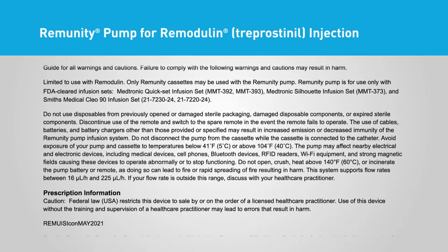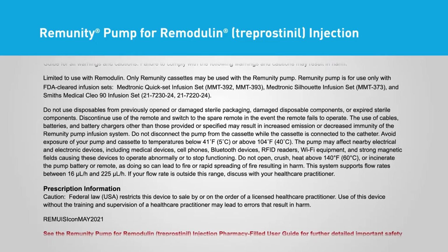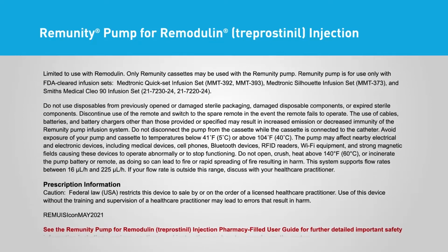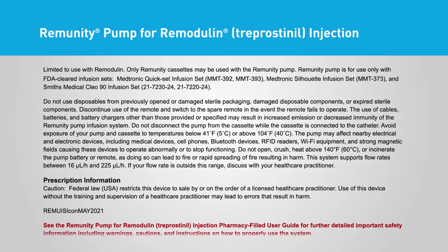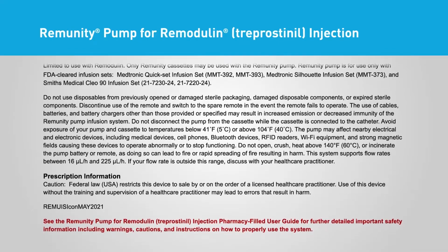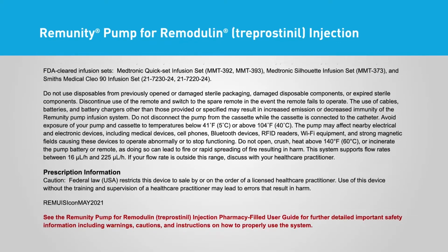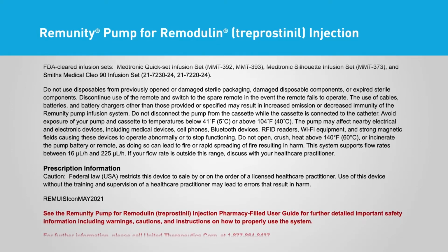The pump may affect nearby electrical and electronic devices, including medical devices, cell phones, Bluetooth devices, RFID readers, Wi-Fi equipment, and strong magnetic fields, causing these devices to operate abnormally or to stop functioning. Do not open, crush, heat above 140 degrees Fahrenheit, 60 degrees Celsius, or incinerate the pump battery or remote, as doing so can lead to fire or rapid spreading of fire resulting in harm.